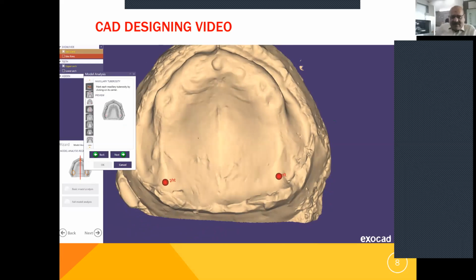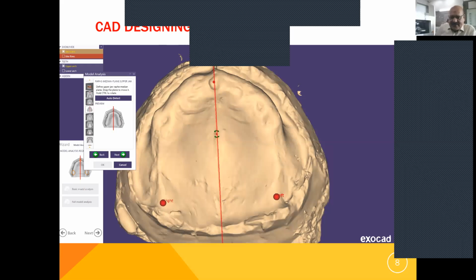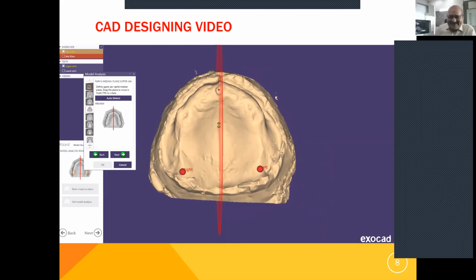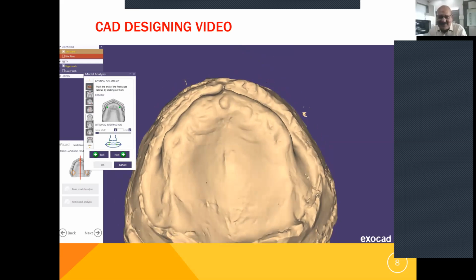We can move. I could still show live today this same file preparation, so that I can interact with the participants, if there are any points missing or not able to be grasped by the participants. We can understand. Yes, of course. This is never rocket science, but when something is new, it looks unfamiliar. That's all I wanted to say.